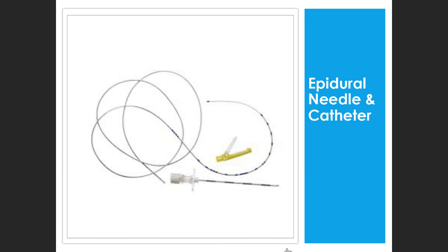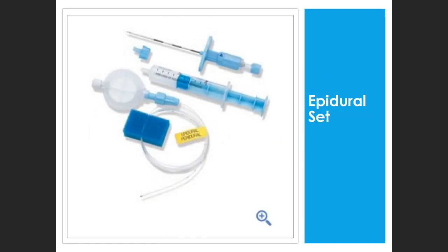All right. You don't necessarily need to know the details so much at this level, but you do need to know that the needle is graduated and the catheter is graduated so we can judge how much catheter we need in this space. Yes, that's really what that is about.